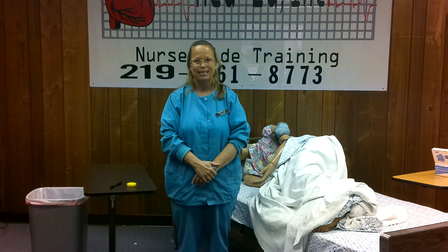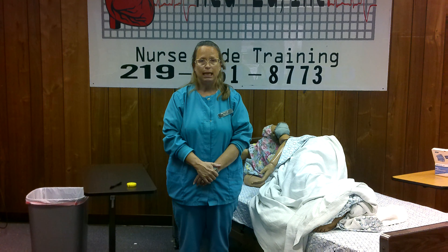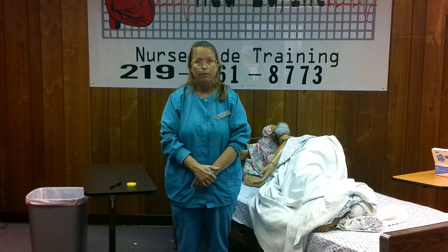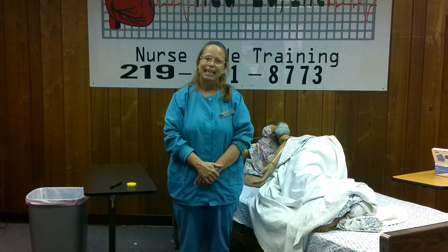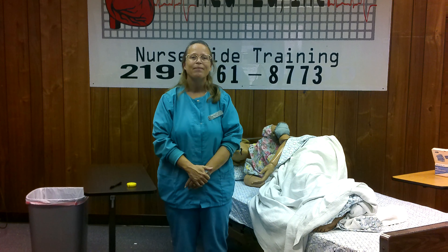After obtaining their height, do your final steps. A: Check alignment and see if they're comfortable. B: Make sure the bed is in the lowest position. C: Make sure they have their call light and water. D: Ask them if they need anything before we leave. E: Everybody deserves a thank you, so thank the resident. F: Find and gather your supplies and clean them to company or facility policy.